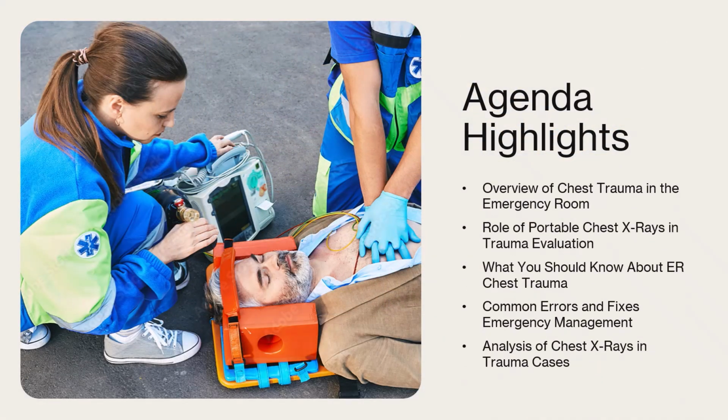We will first review chest trauma causes and triage in the ER. Then we'll explore the benefits and limitations of portable chest x-rays in trauma evaluation. Next, we will discuss interpretation of common and subtle injuries, and finally we'll cover how imaging guides emergency management and follow-up.